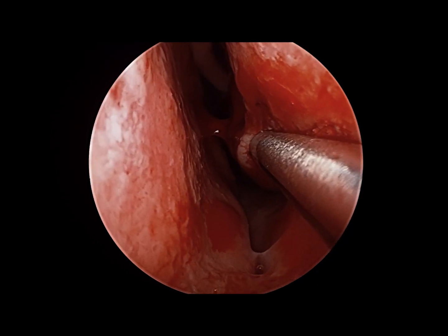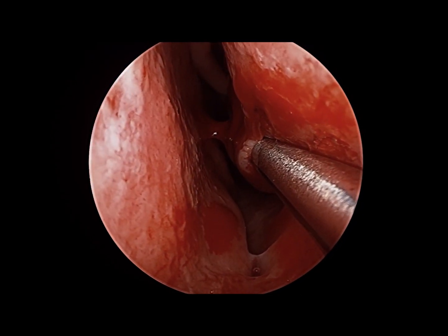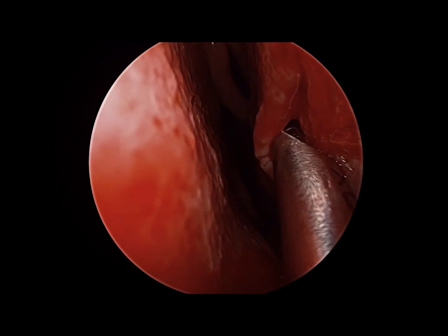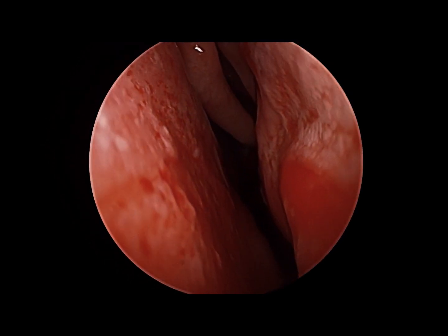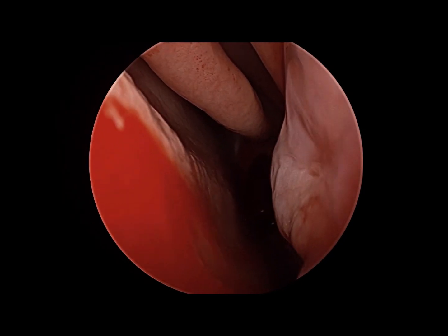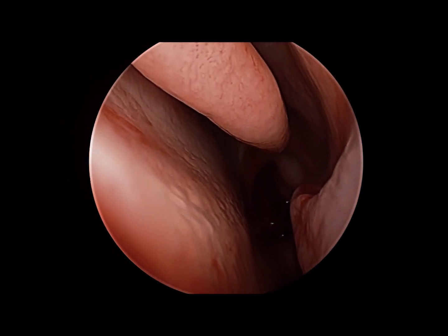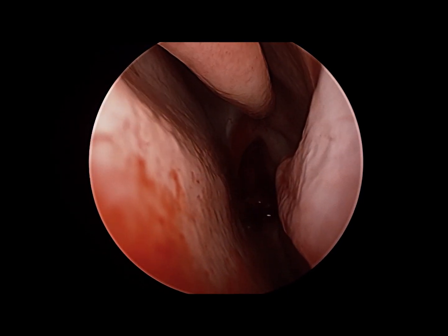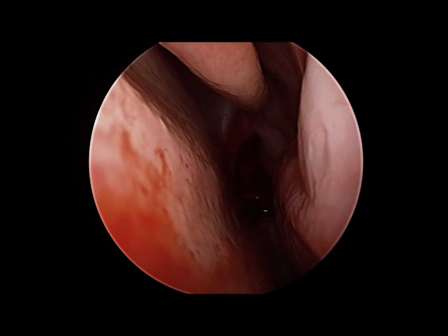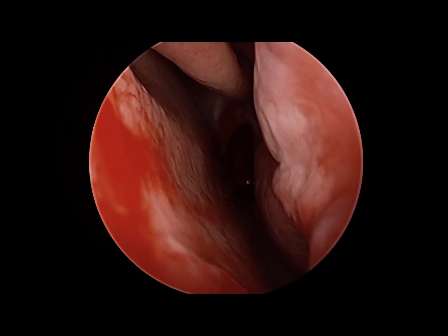Typically we would also out-fracture these inferior turbinates after we have treated the submucosal component, so that we will not cause any small fragments that would cause our microdebrider to hang up as we are trying to create a tunnel to remove the submucosal vessels.